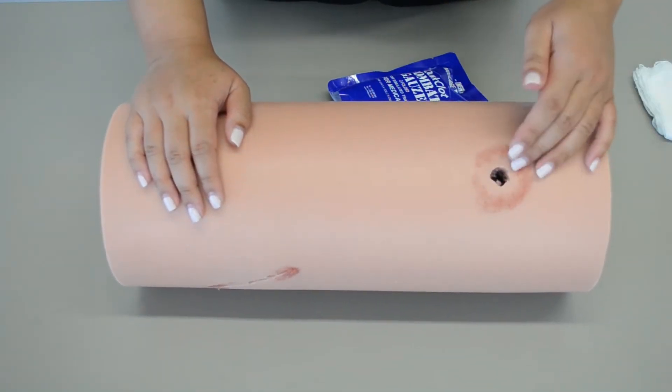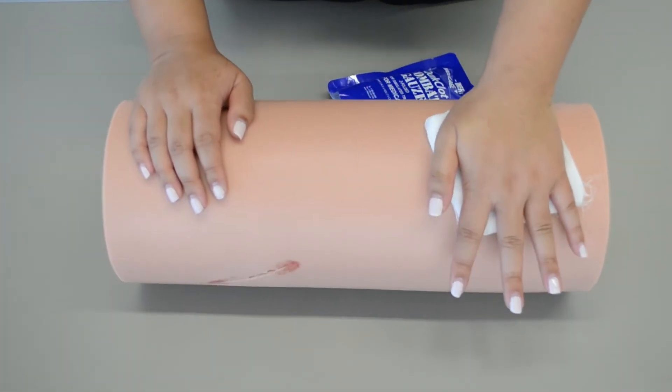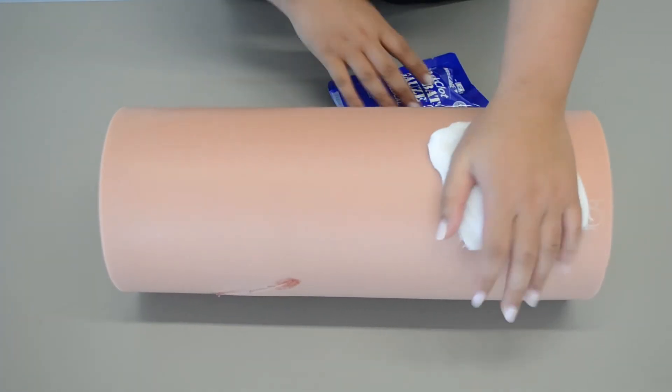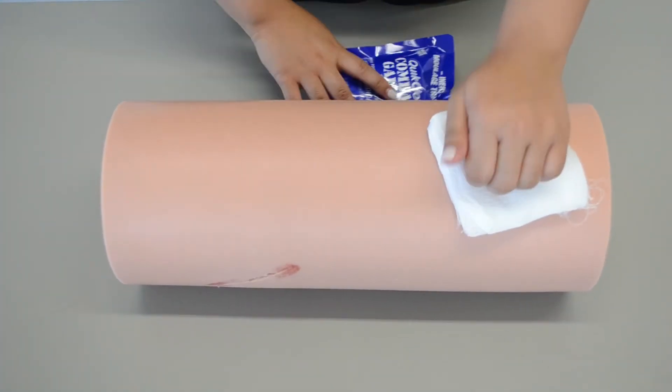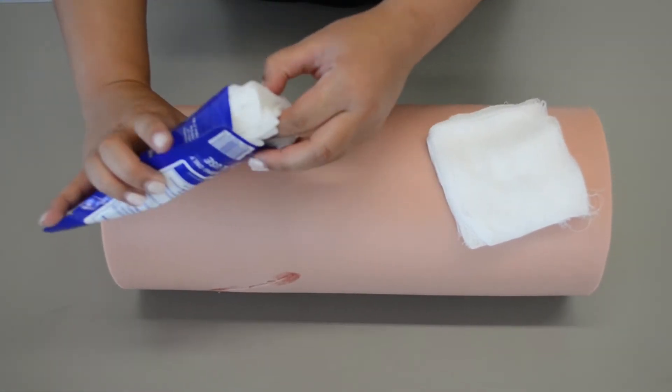So just like any other wound, you're going to go ahead and control the bleeding with direct pressure. After three minutes of direct pressure and the wound continues to bleed, I'm going to have my partner maintain direct pressure while I get the combat gauze ready.